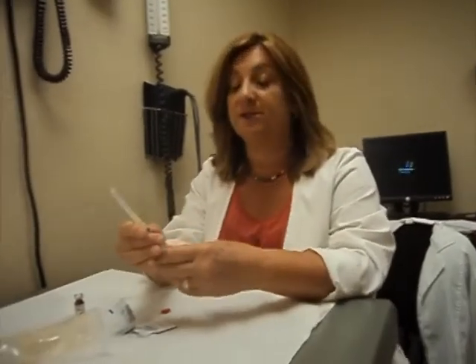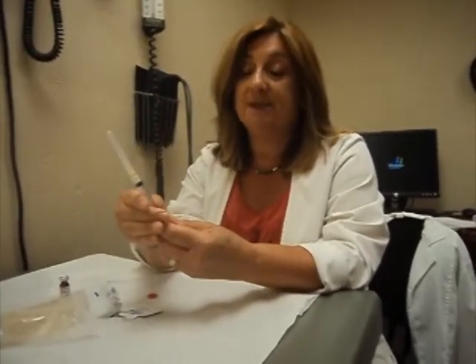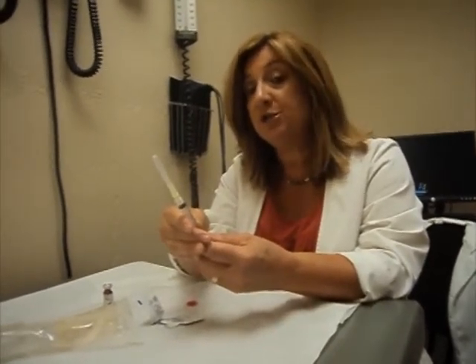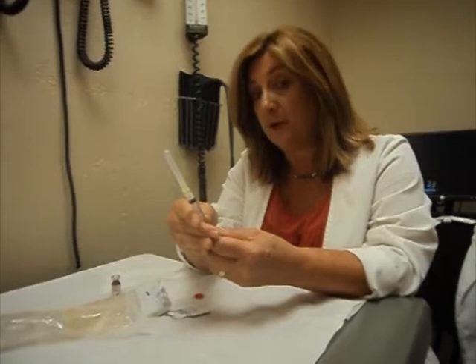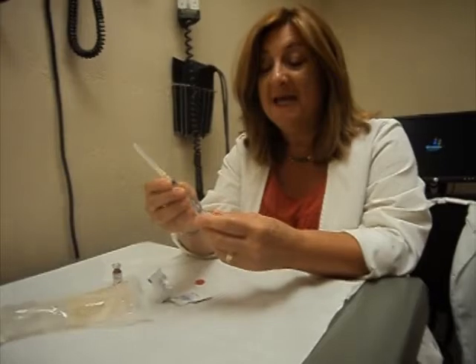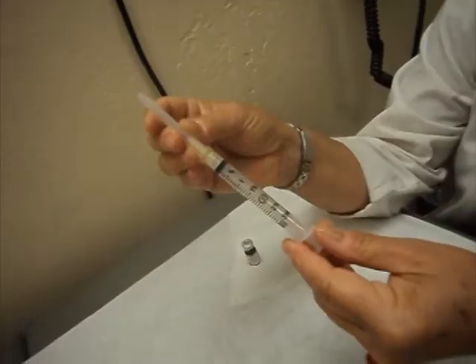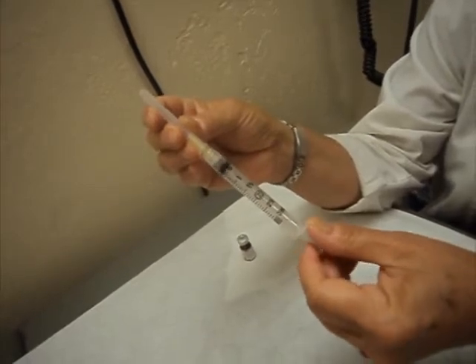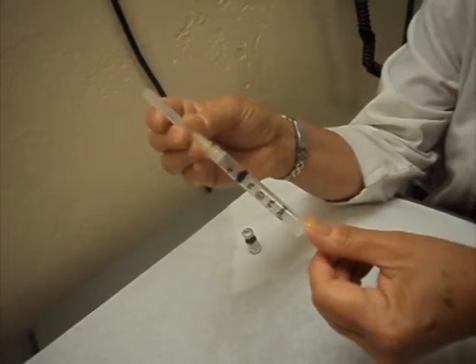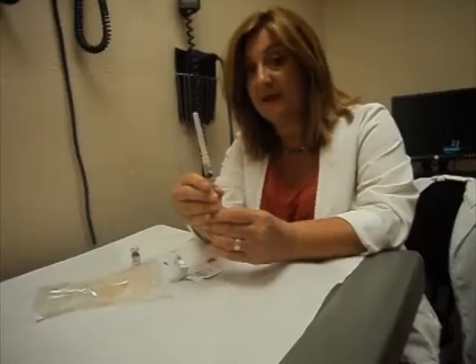Let's get familiar with the syringe a little bit. When you're going to draw up your dose, the doctor will tell you how much you're going to be taking. In vitamin B12, it's usually 1,000 micrograms, and in medical talk this will translate to 1 cc. As you can see on the syringe, the markings are pretty clear, and what you want to do is pull the plunger back to the line that's closest to the needle with your dose. And as you can see, I've drawn up 1 cc of air.